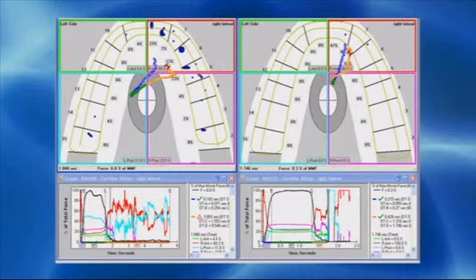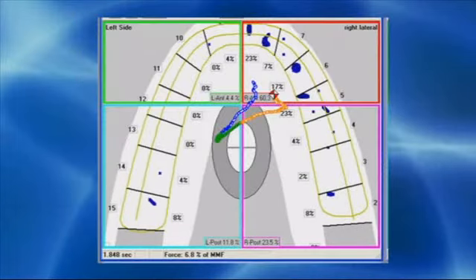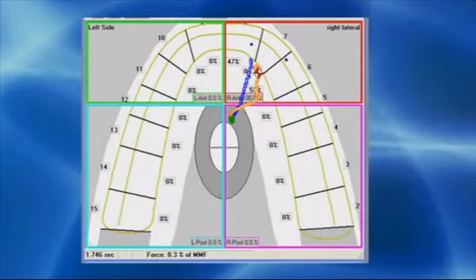In order to compare the before and after right or left excursions to each other, you need to look at how far into the excursion preoperatively compares to when the person discludes postoperatively. So here in movie 0.408, the timeline is to the right of C in the graph, 0.428 seconds, which is the actual postoperative disclusion time. What you can see in the two-dimensional plot above the graph is that there's posterior teeth in contact on the screen. Tooth number 15, number 14, number 2, number 3, number 4, and some of number 5 are all in contact after the patient has moved to the right only 0.428 seconds in the preoperative condition. Postoperatively, after the patient has moved 0.428 seconds into the excursion, there's no posterior tooth contact behind the canines.